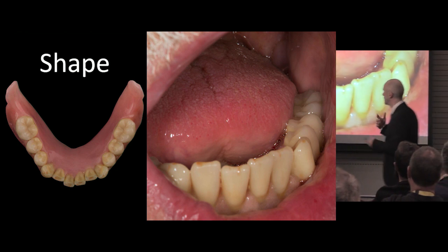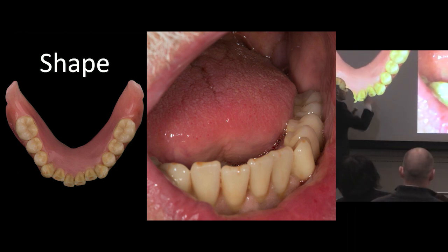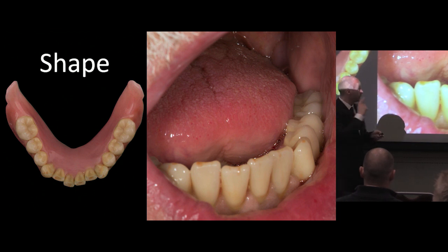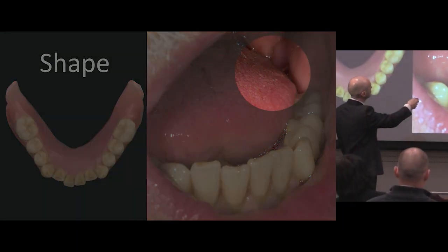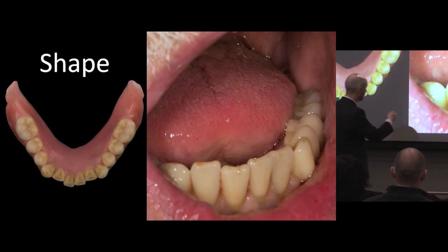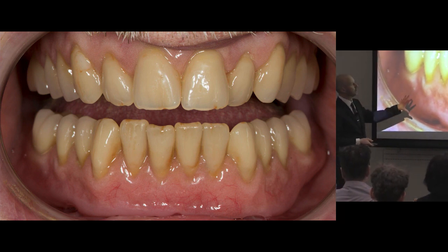And the secret is very much the shape of the denture, this periphery, and the way that the soft tissues all envelop the denture. And one of the secrets to this, it's really important, is just up here. Can you see that? There's a little bit of acrylic, and that covers the retromolar pad completely. Really important part of the design. And then these are Bert's dentures in place.